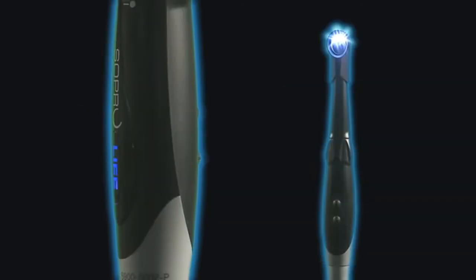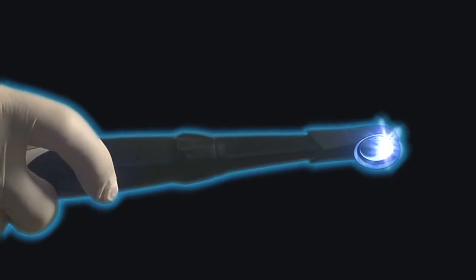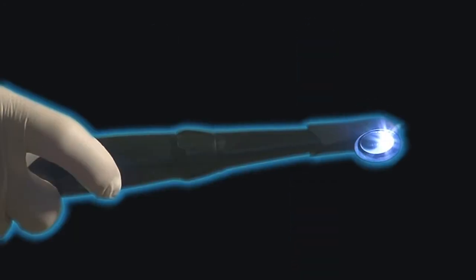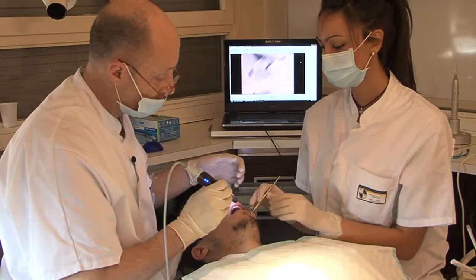Soprolife is a system for observing the condition of hard dental tissues during diagnosis and treatment. Its principle is based on the analysis of light induced fluorescence images. This amazing system ensures highly efficient detection of potential tooth decay.